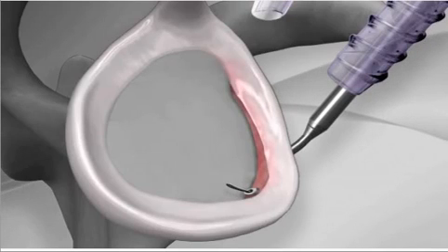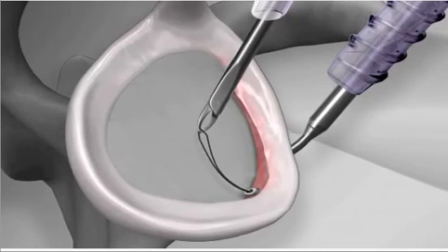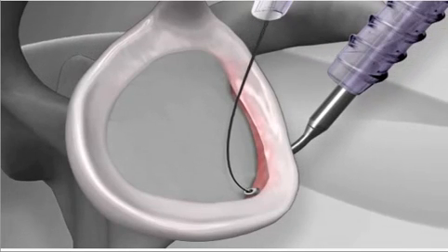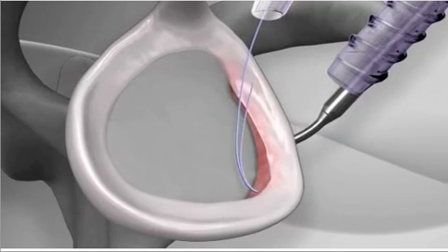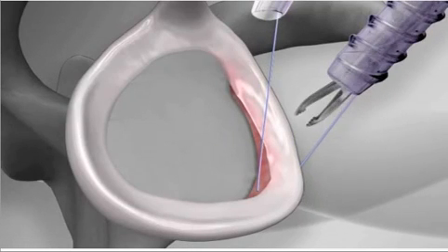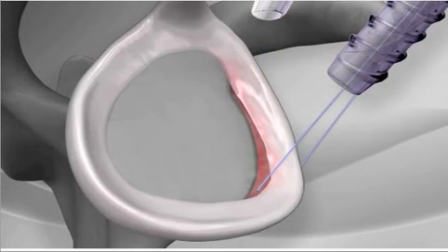A looped wire is passed underneath the labrum and retrieved through the anterior cannula. A suture is shuttled around the labrum using the wire. The suture is retrieved and a drill is inserted into the joint.